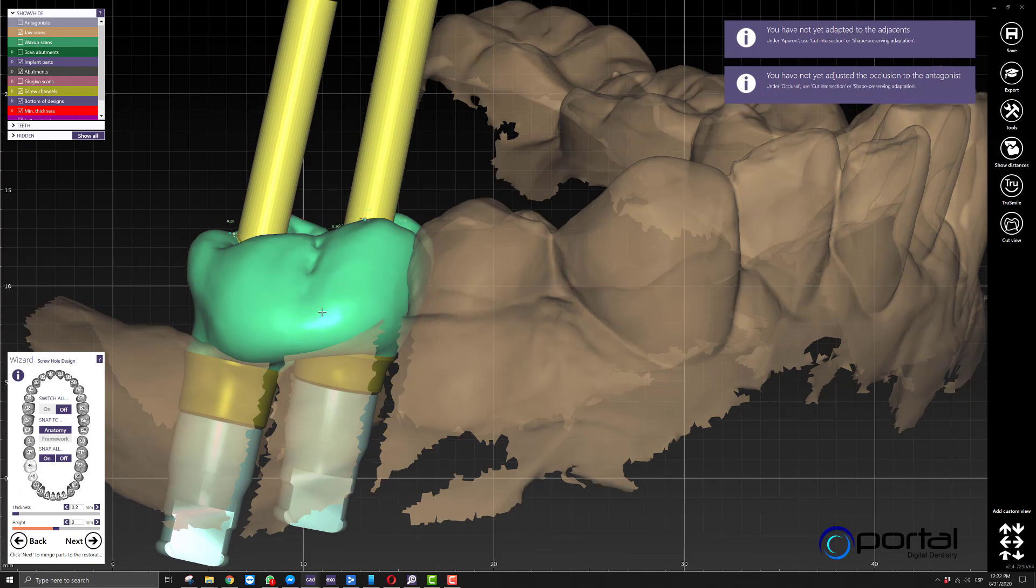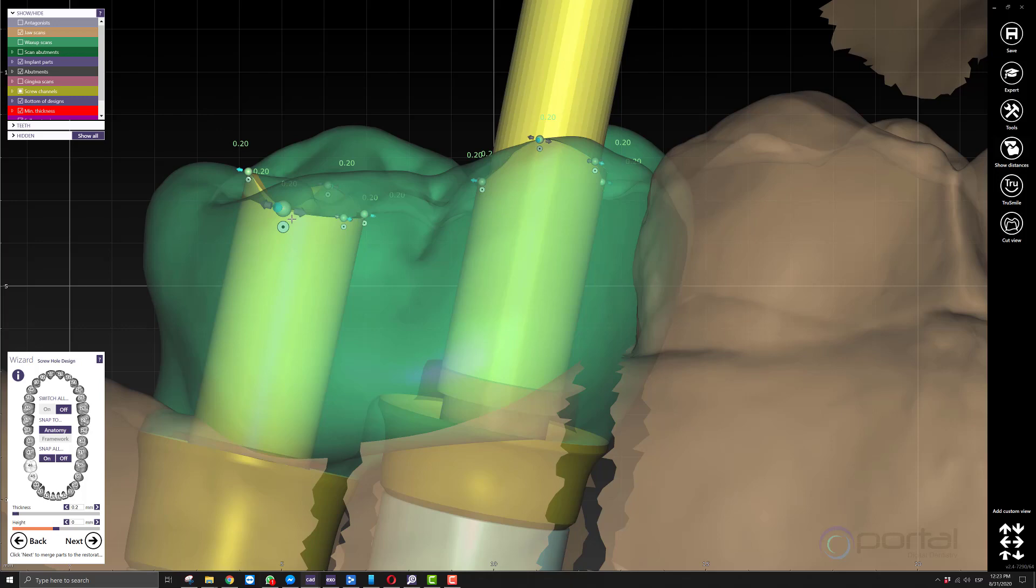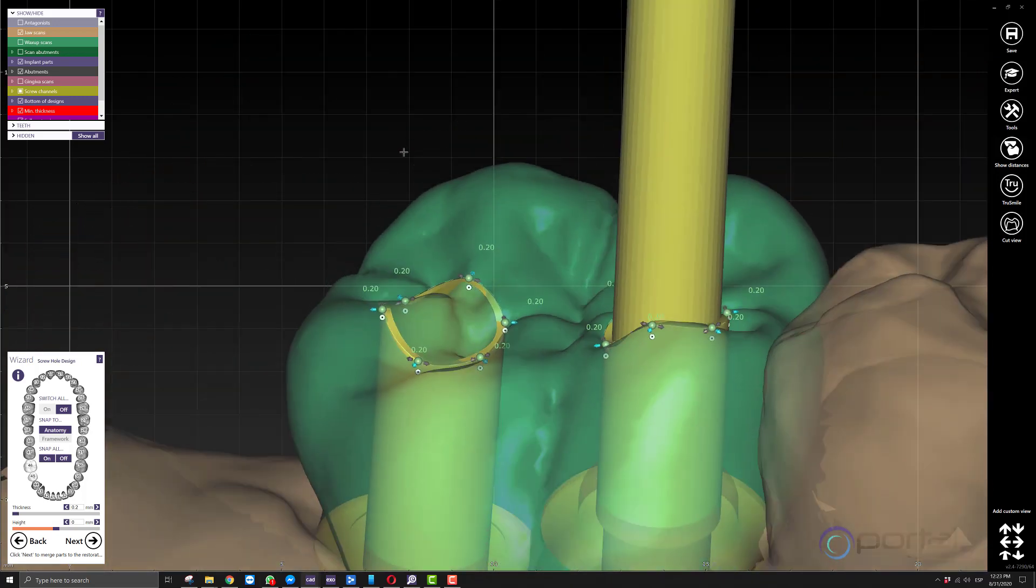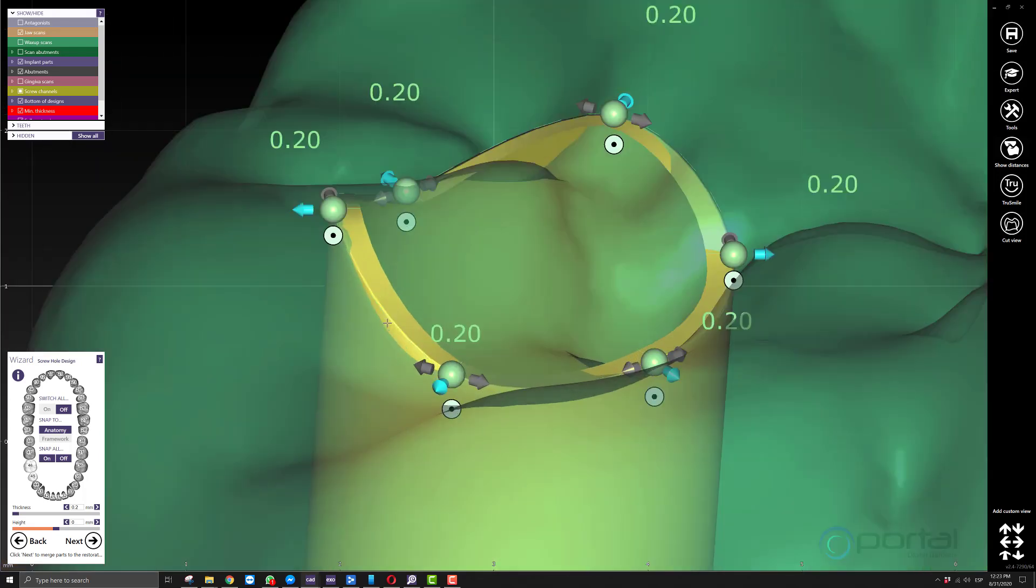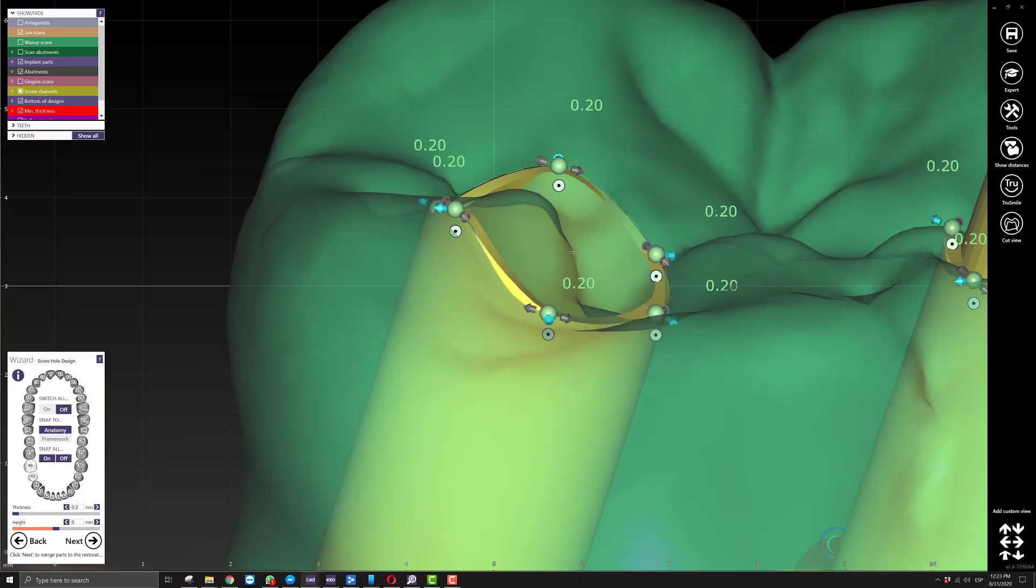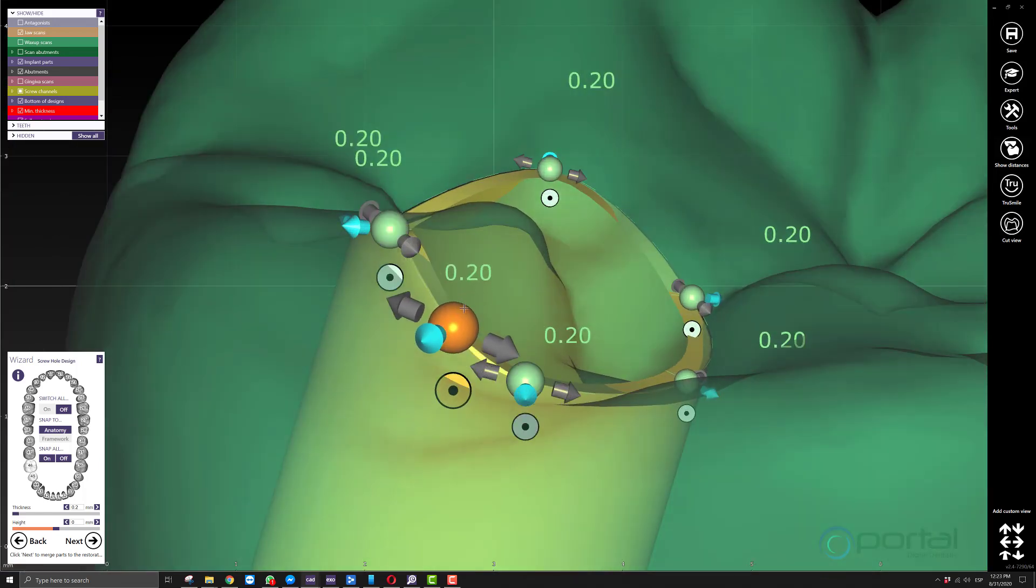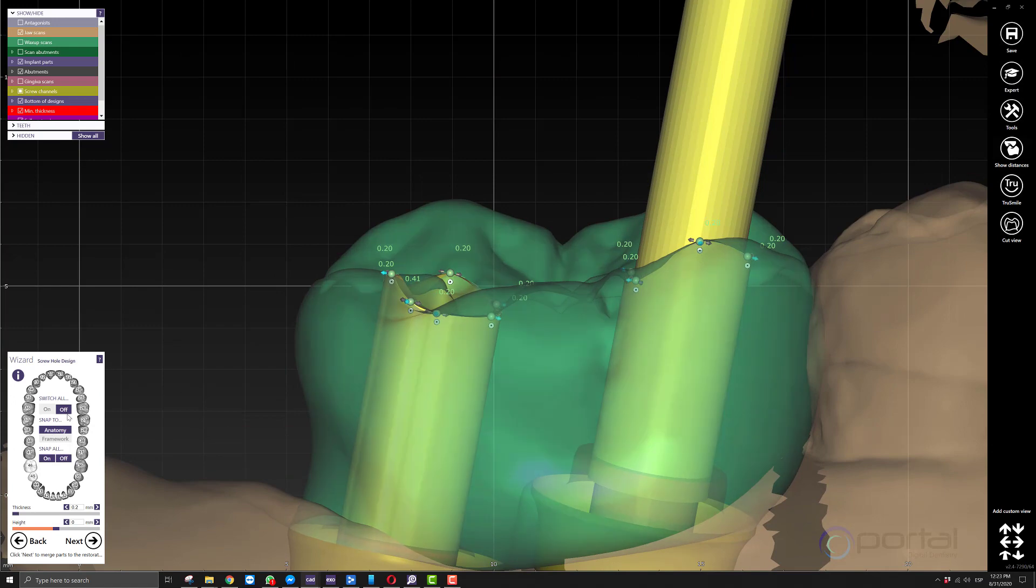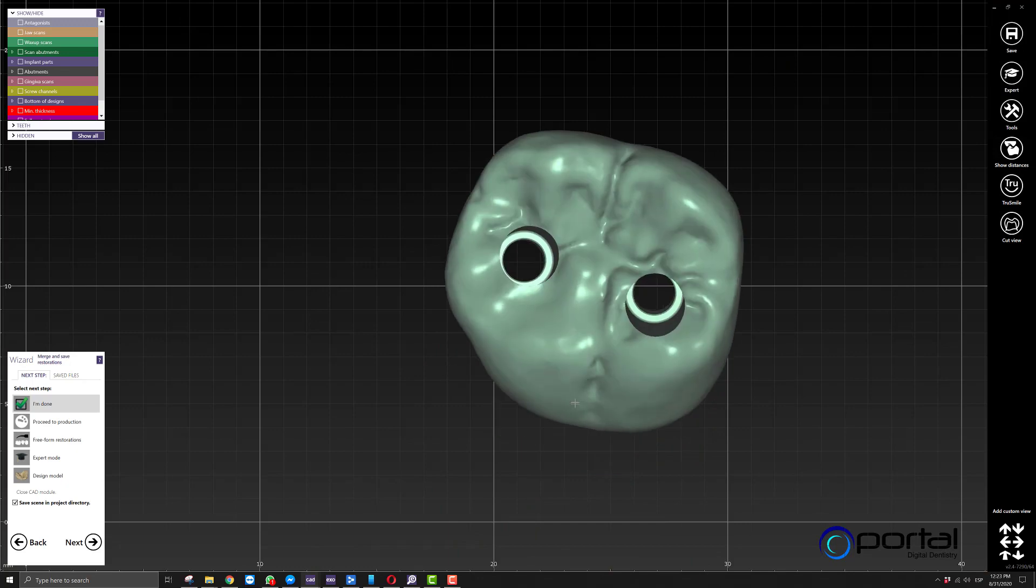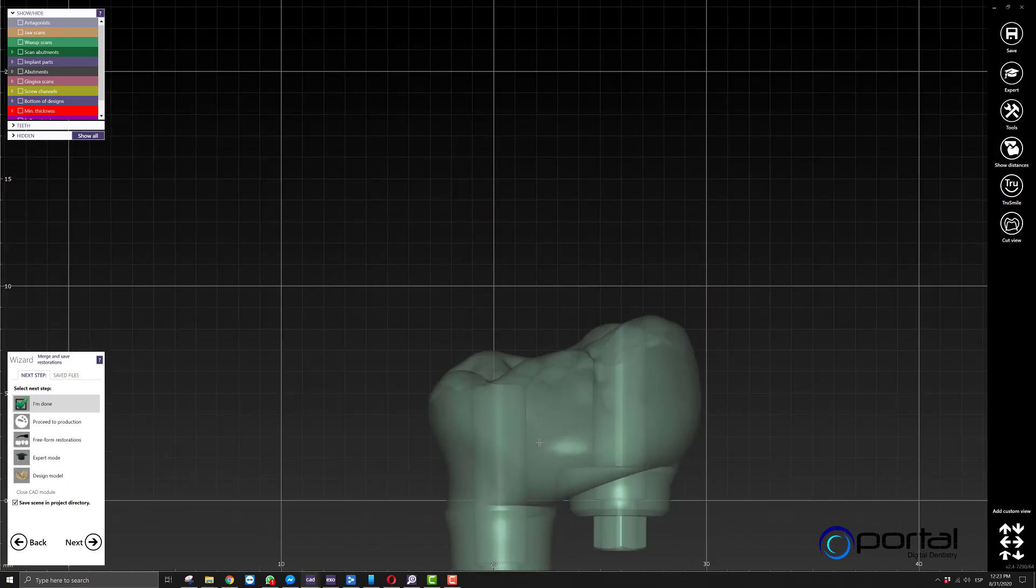There's one more thing: the software asks whether we want to design the cylinders that are done for protection so there's enough thickness around the screw channel so it doesn't chip. The only problem is the structure is never flush with the surface of the crown. Instead of adding points and moving it around so it's flush, which takes too much time, you can just turn them off. The software will finish the design without making you design those cylinders.